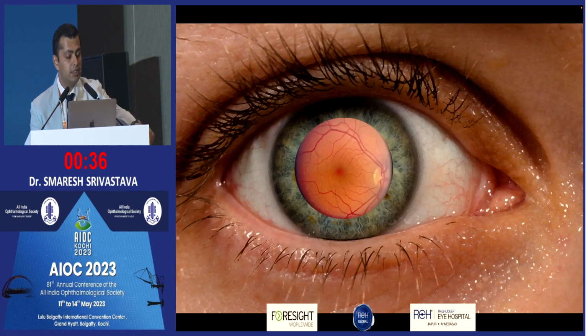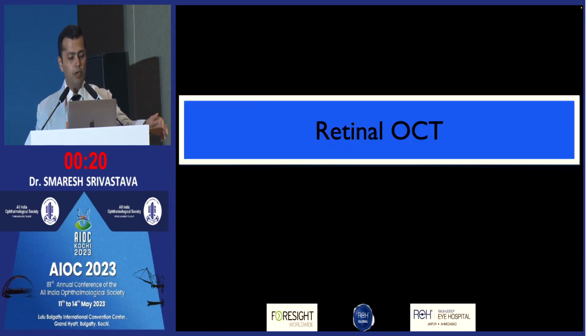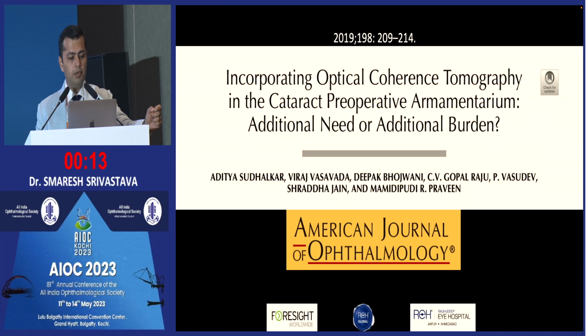Last but not the least, retinal evaluation. I think this is not an indulgence anymore. I think it's preferably required if your practice can support it, is not only to do a dilated evaluation. We've actually started imaging all retinas now. So we have a dedicated SLO which does captures for all retina as a part of the OPD workup, not even a pre-op workup. But the more important thing is to do retinal OCT, because what your eye can't see, the OCT will pick up.